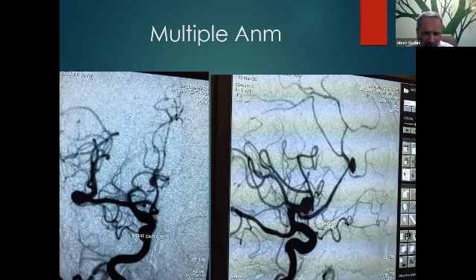And there is another thing which I want to add. If you do this aneurysm on the second day, it will behave totally differently. If you don't get a chance to do it on the second day, and do it after 10, 14 days, the shape of the aneurysm and the perianeurysmal architecture will be totally changed. So even this change could help the patient. And everyone knows, an aneurysm bigger than 4 or 5 mm has to increase in size. So size and perianeurysmal architecture could help you a lot to play with the simple coiling, which we are doing.